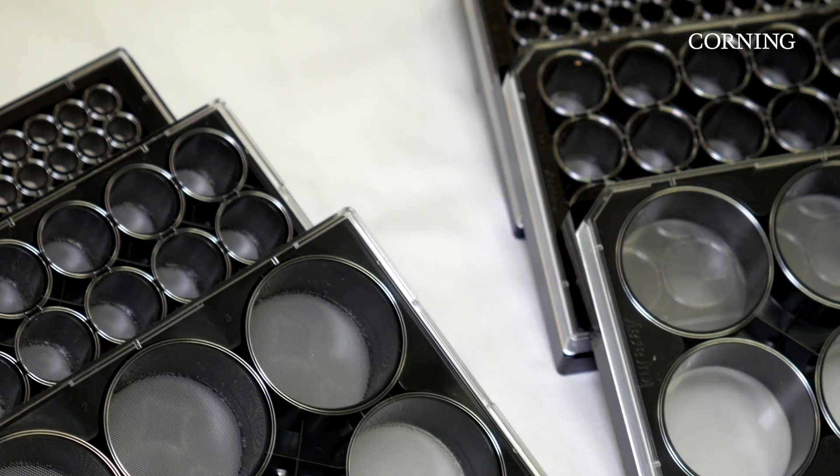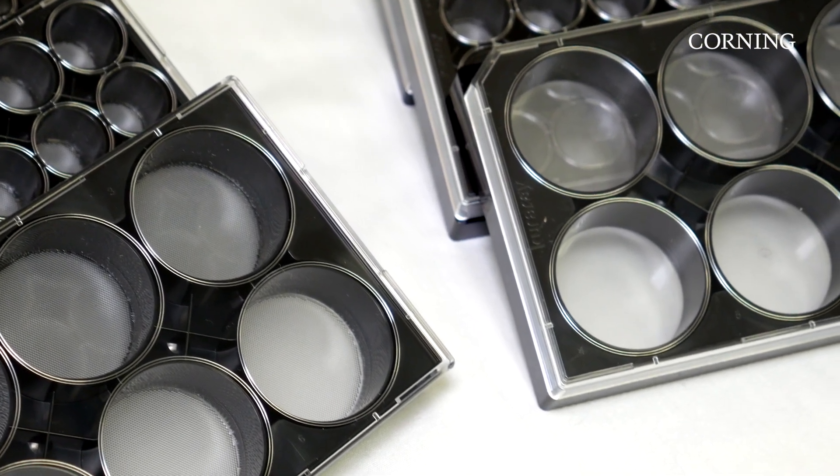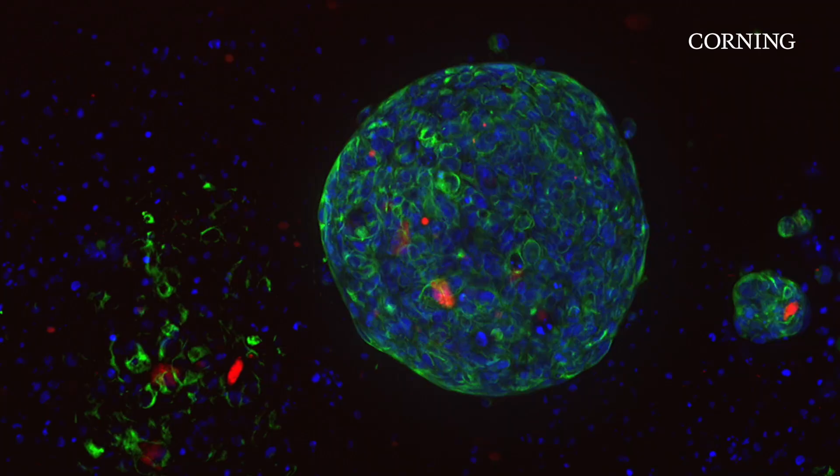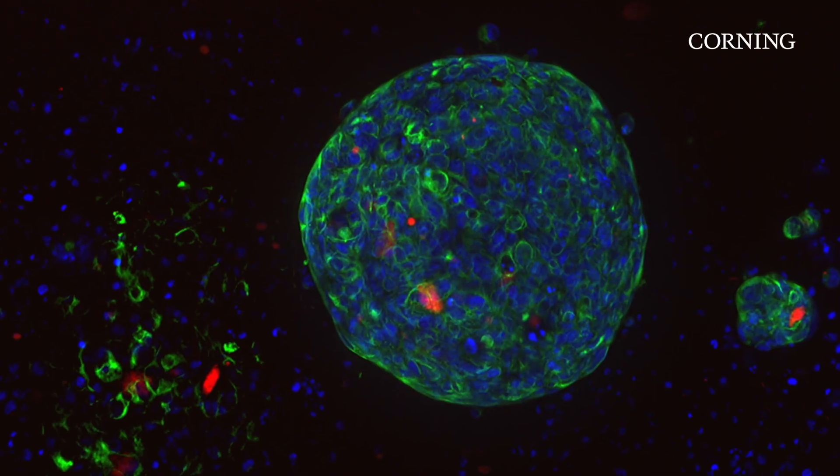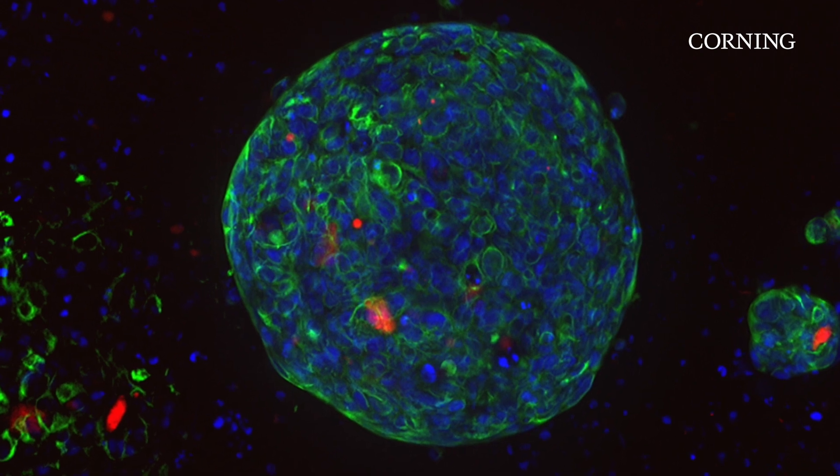Elplasia plates are available in multiple formats with either round or square bottom geometries and two surface coating options. They may be used across many applications including drug discovery, cancer, stem cell, and cell therapy research.